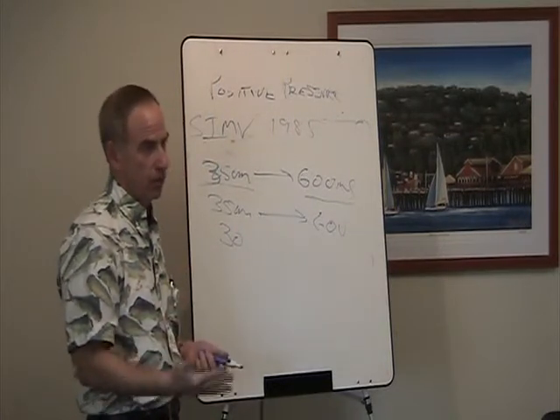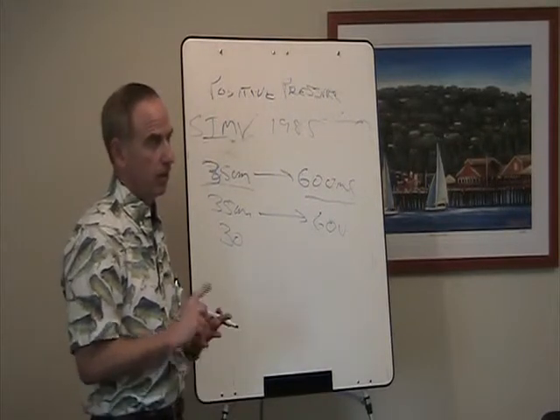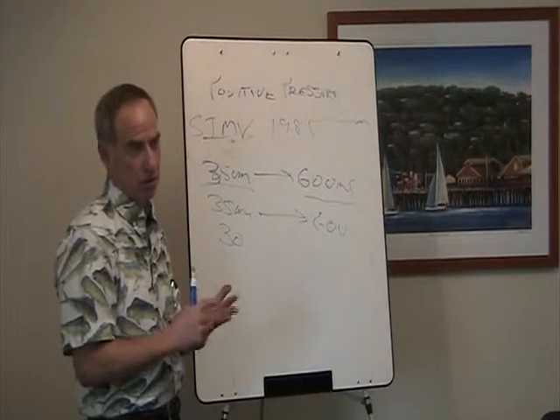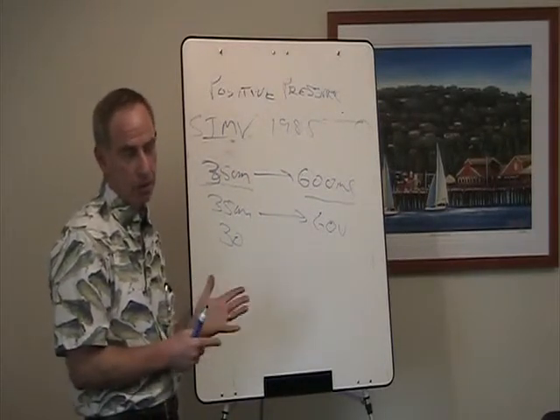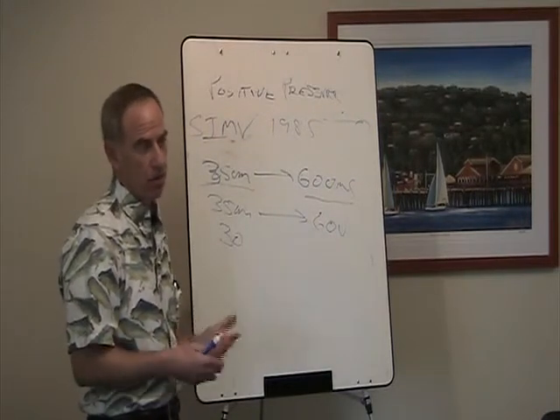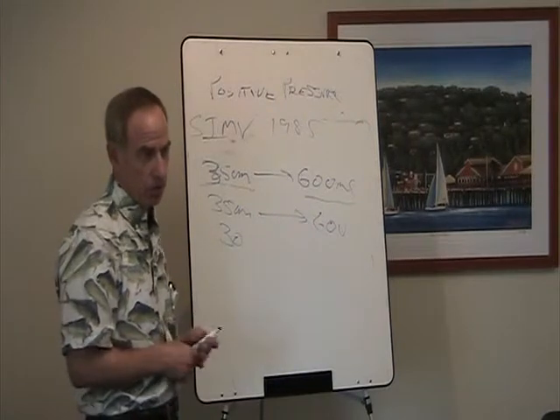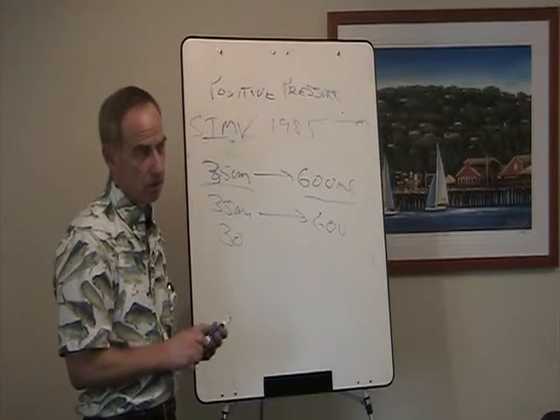But the modes that I've talked to you about, so assist control, SIMV, pressure support, probably not even pressure control. Those three modes, assist control, SIMV, pressure support, you should be able to ventilate 95% of patients, maybe more, with those modes, and not knowing anything else. As a general internist, that's all you should need to know about. If you get to the point where you can't adequately ventilate somebody with one of those modes, you need to get somebody who knows a lot about ventilation, a specialist.